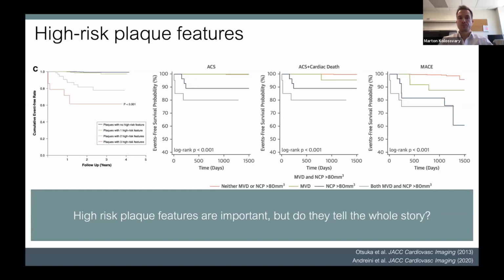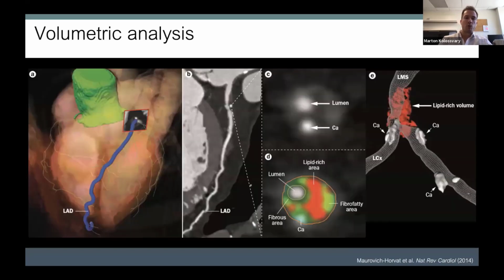And also, we are still losing out on a lot of information because radiological images are actually physical measurements where we have an exact measurement in each voxel representing the density of that tissue structure, which might have information. So we need some kind of method to analyze this. For this, we can use quantitative analysis.